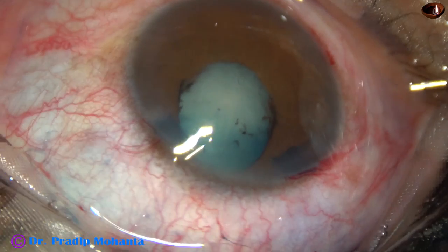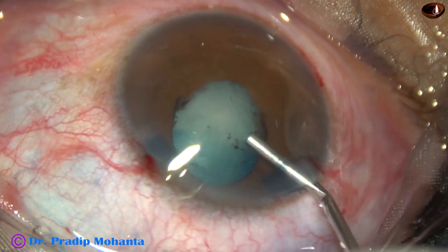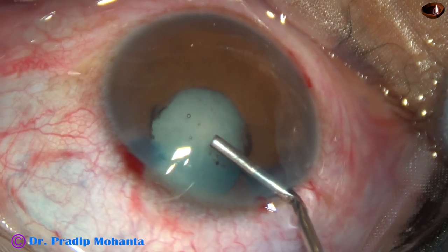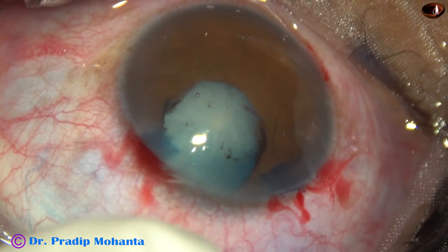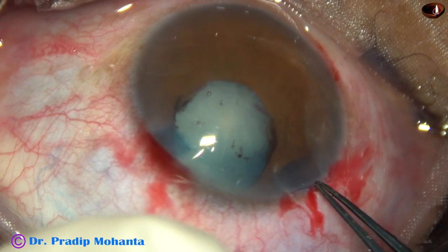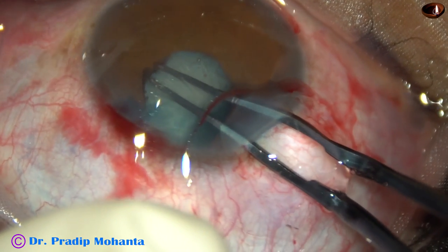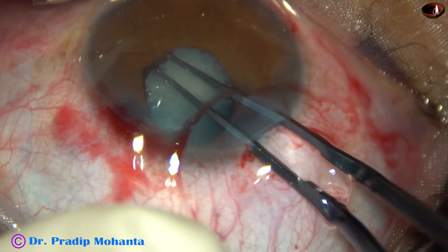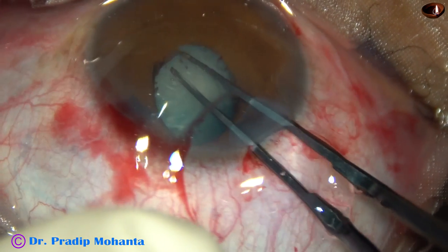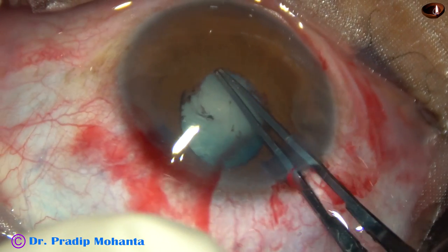Now I want to remove the fibrous band from 10 o'clock to 2 o'clock. So I have injected some viscoelastic, 2% HPMC. Now with the help of the utrata forceps I try to hold the fibrous band at 2 o'clock, but I was not successful.